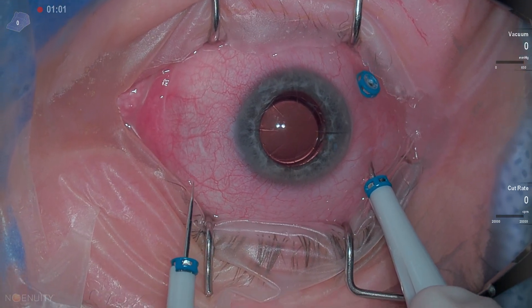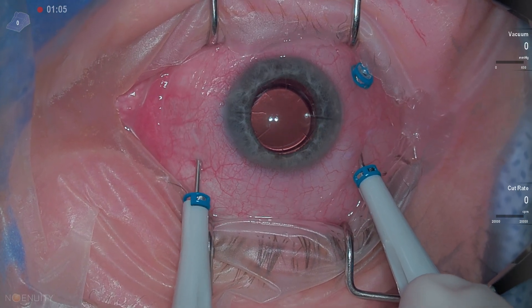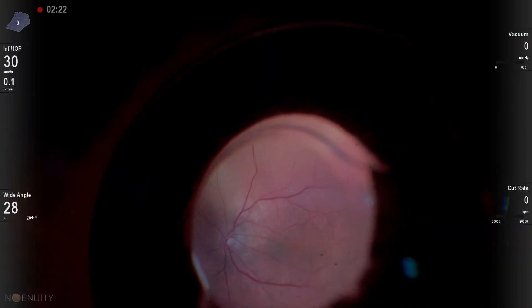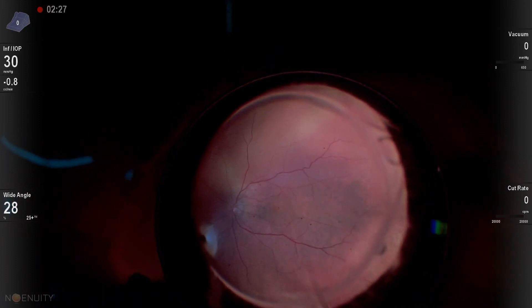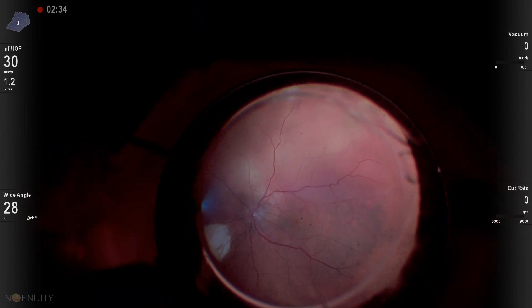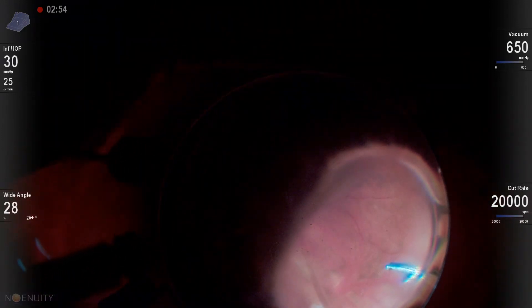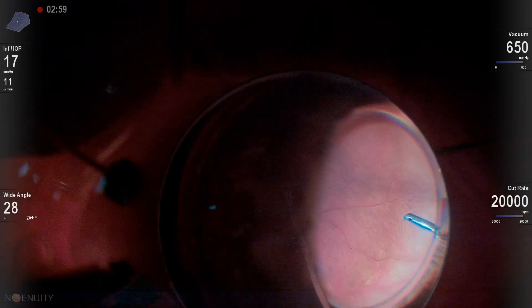This is a video that involves leaving perfluoron in the eye. This was a patient that had had surgery by one of my colleagues — I know that because I don't put draining retinotomies so close posteriorly and don't laser them so heavily. The patient had a primary vitrectomy for a retinal detachment. You can see the patient previously had RK, has an IOL in the eye, and had an inferior retinal detachment. Leaving perfluoron in the eye is really good for specific cases, this being one of them — a patient who has a recurrent inferior retinal detachment.